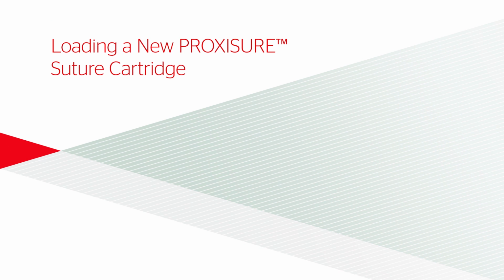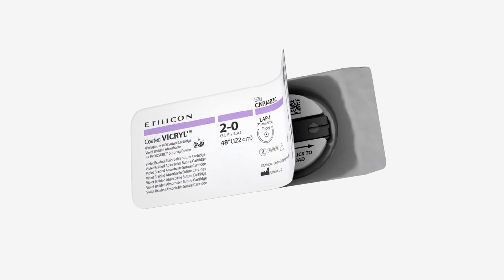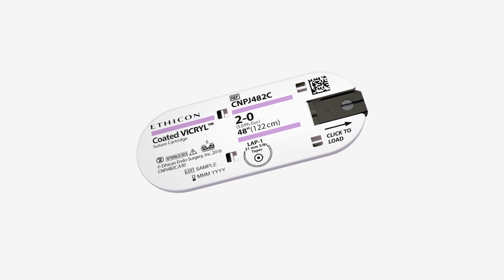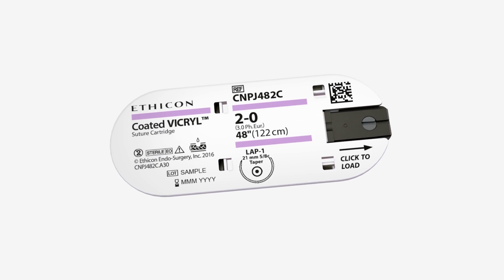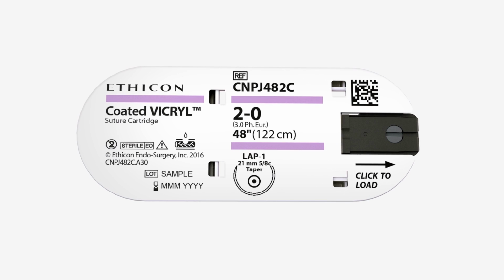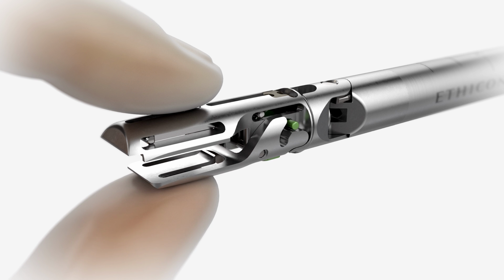Loading a Proxisure suture cartridge. Using sterile technique, remove the Proxisure suture cartridge from the package. It is recommended to only load a suture cartridge that is in a suture cartridge tray to prevent inadvertent needle sticks. Prior to loading the suture cartridge, ensure the jaws are parallel to one another.